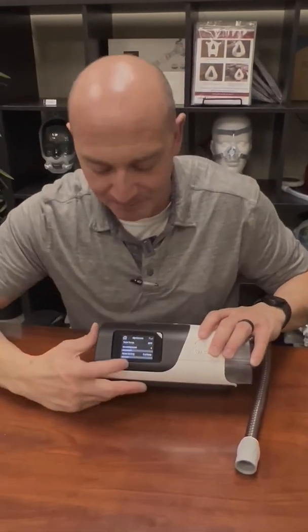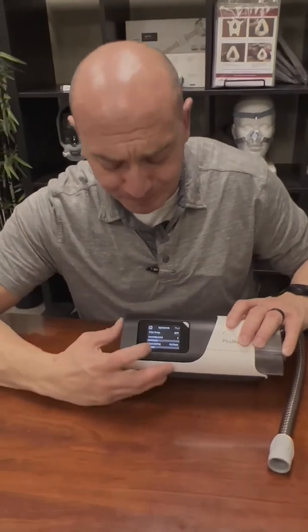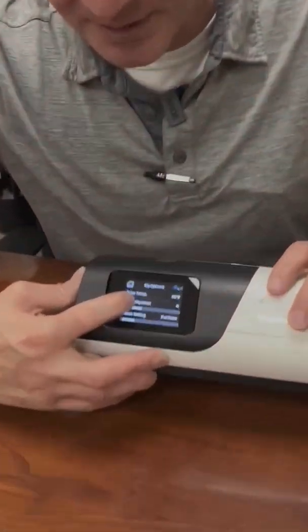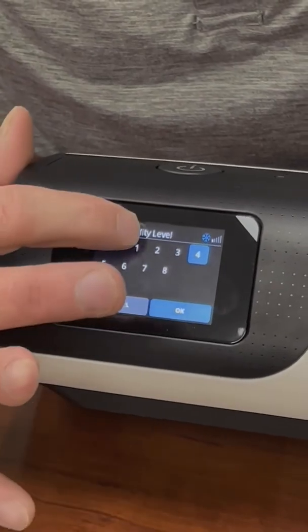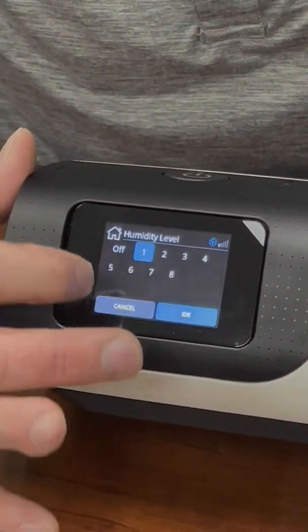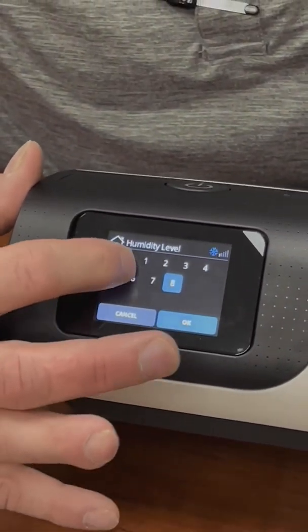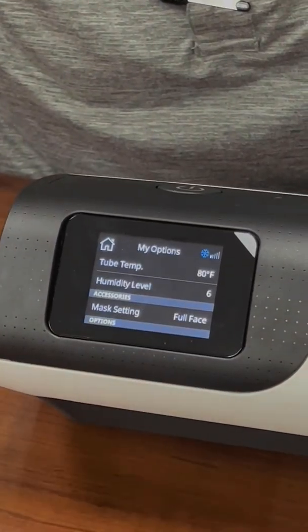Me personally, I prefer the manual because I can have greater humidity at cooler temperatures, and it's just a little bit more comfortable that way because I have a lot of sinus issues. But you can see on your humidity level, it's anywhere from 1 to 8, and you just touch the number that you want. I'm on a 6 at home, and then just hit OK.